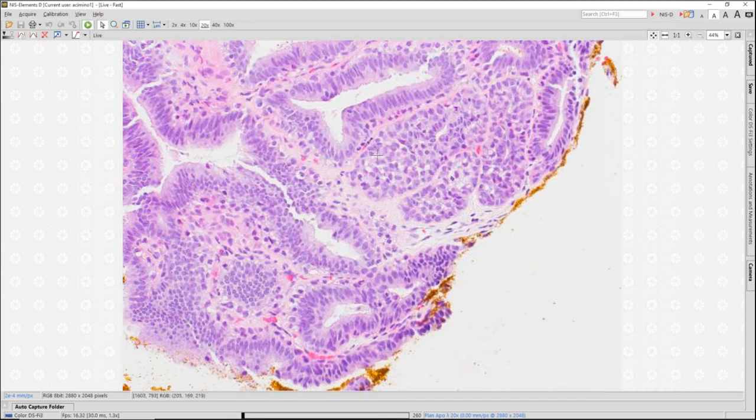The finding that accounts for the radiographic finding is the papilloma, and the ALH is sort of a bystander, accompanying the proliferation. It's not leading to the radiographic findings. So in those cases, excision is not absolutely indicated for incidental, non-radiographically evident ALH. Right, so that's a change from the management in the past.